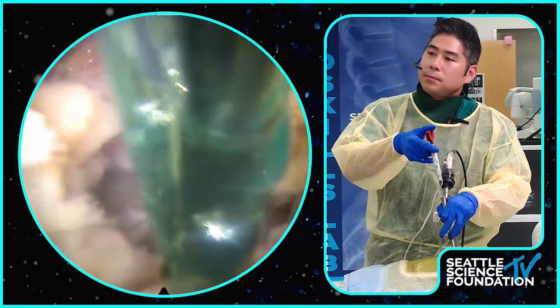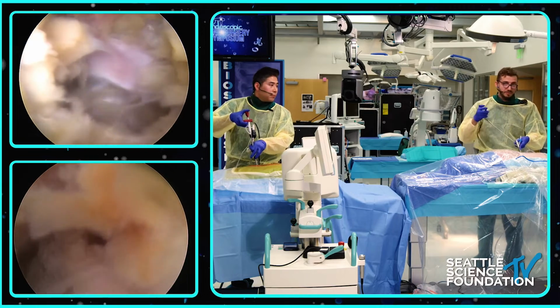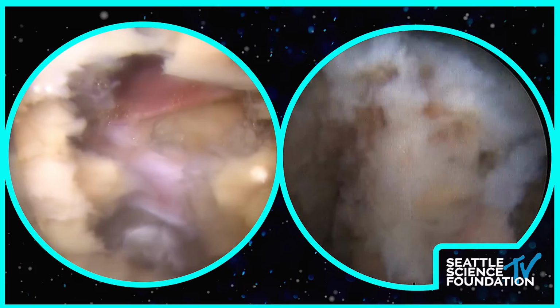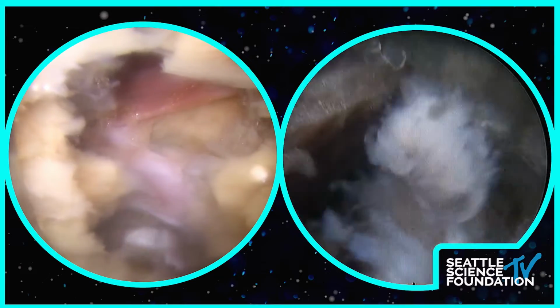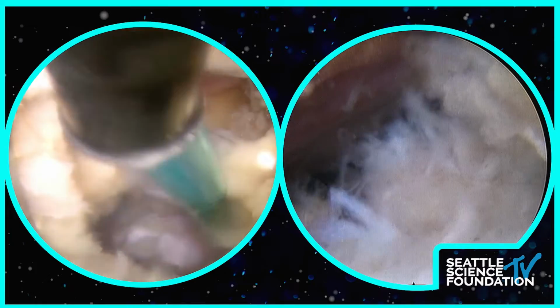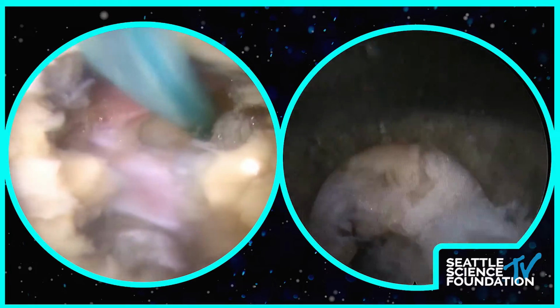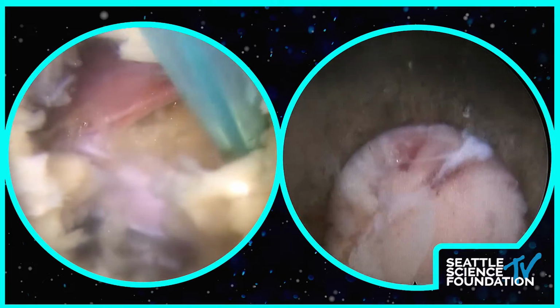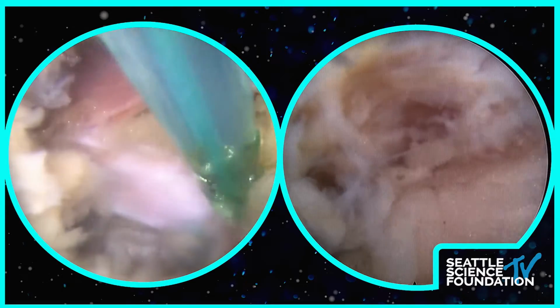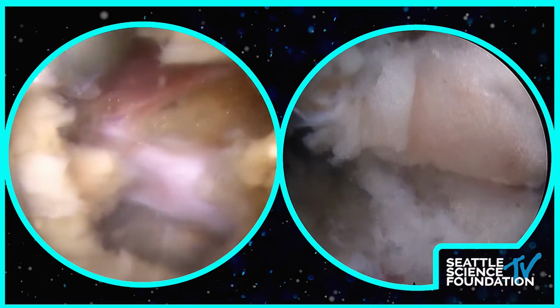Ben, can we do a side-by-side showing both endoscopic views? Awesome. So let me show the traversing root here. All right. So here's our traversing root on my side. Right there. So it's a traversing root from both the interlaminar and the transforaminal approach. And then the exiting root, I've started seeing it up here. So again, you have to look in a different plane. I was just kind of clearing it out, but it's going to be right here over where this fat is. So I'm just going to start clearing it out so you all could see it. But it's in this fat plane right here.